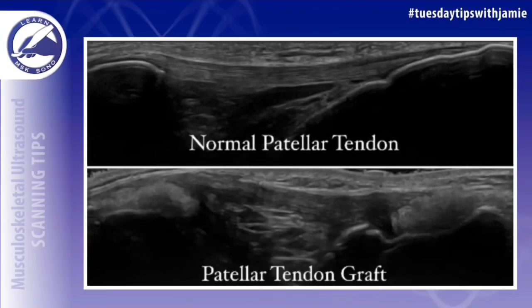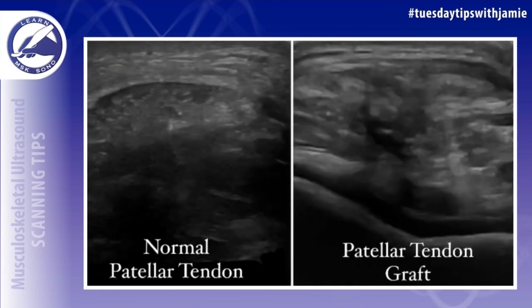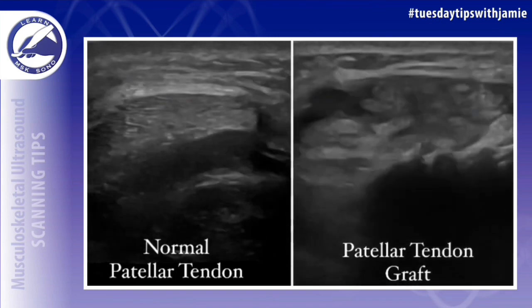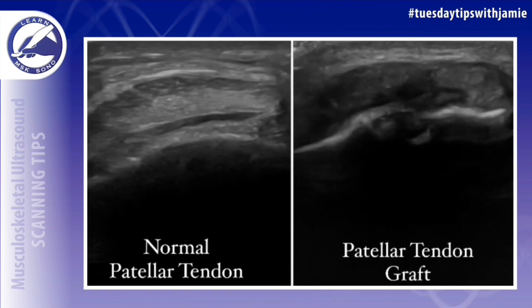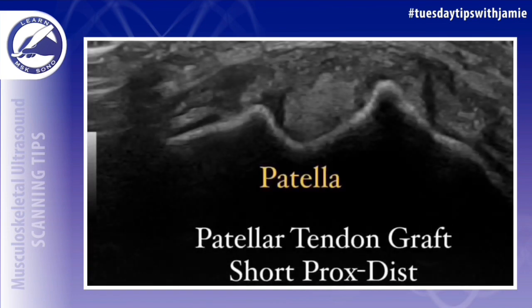It's very important to ask the patient if they've had any knee surgeries before you do their ultrasound exam. This kind of patellar tendon appearance could easily be mistaken for pathology if you don't know the patient's surgical history. If you know that the patient has had an ACL repair, then you'll expect to see a patellar tendon that looks abnormal like this. You can also do a contralateral comparison to the normal side to show the difference.